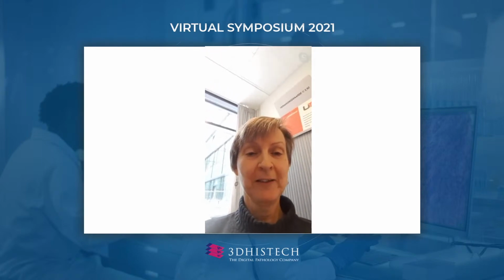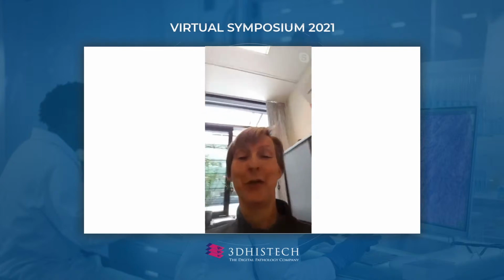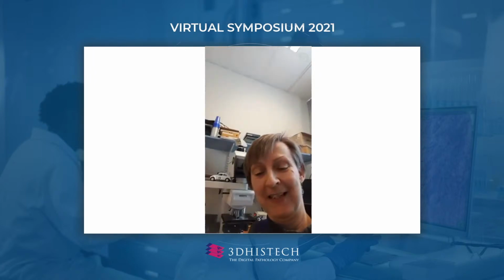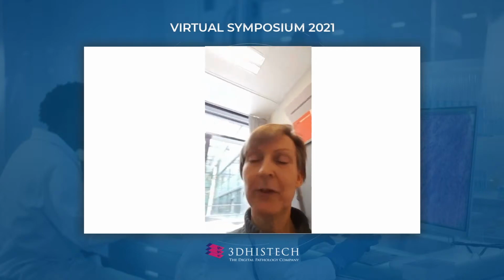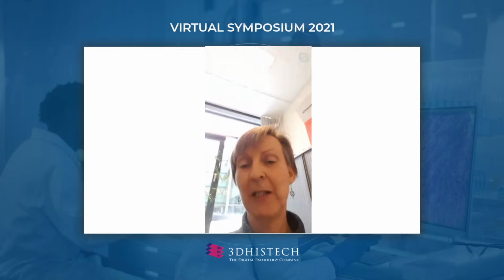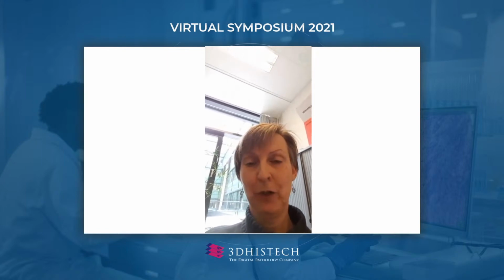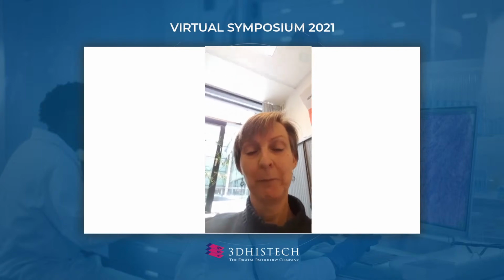So the first question is, have we completely removed the microscope from the pathology rooms? No, as you can probably see in the background, I still have a microscope. We all still have our microscopes, because our external consultation cases are not yet scanned. We are in the process of doing that. And also the cytology is still done by microscope. So we still have the microscope, but I really would like to get rid of them completely.